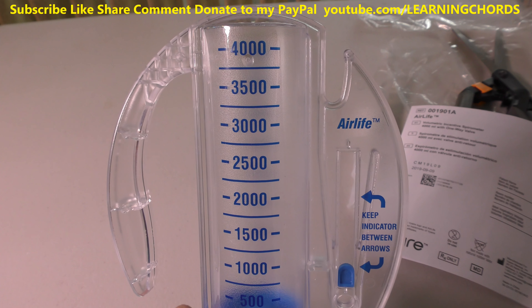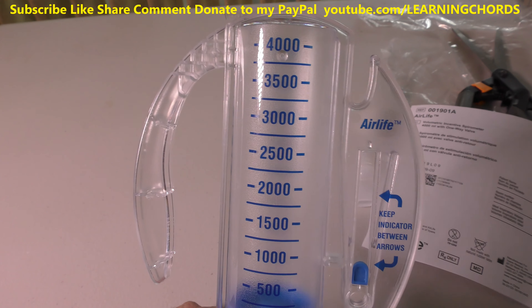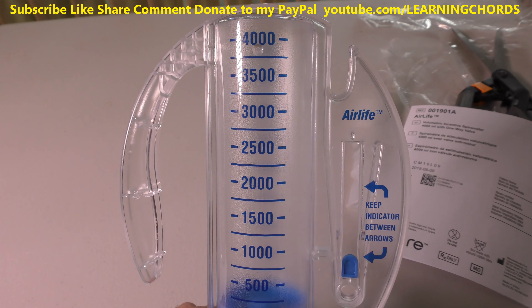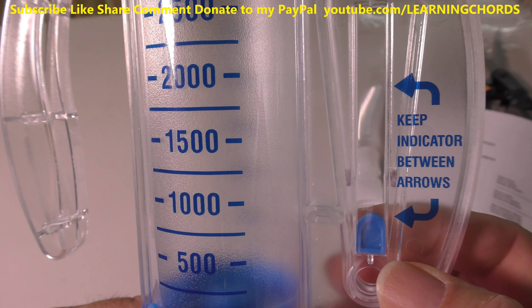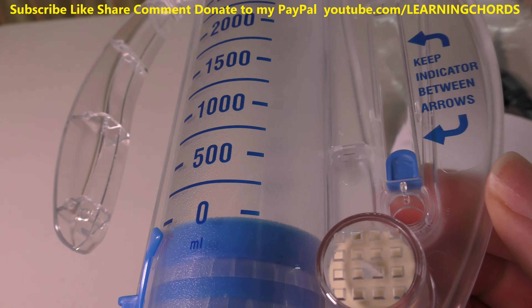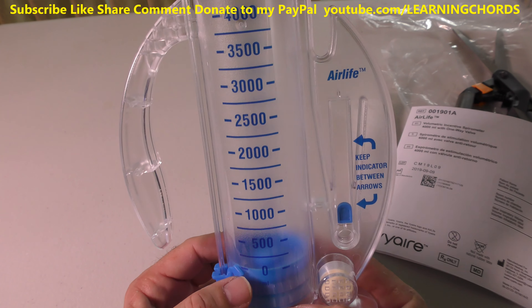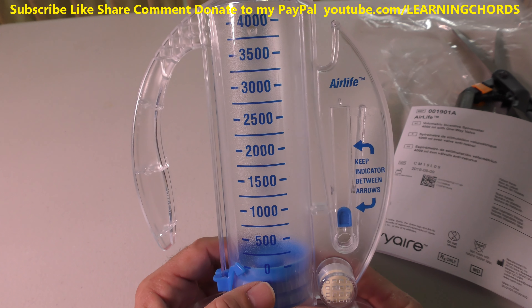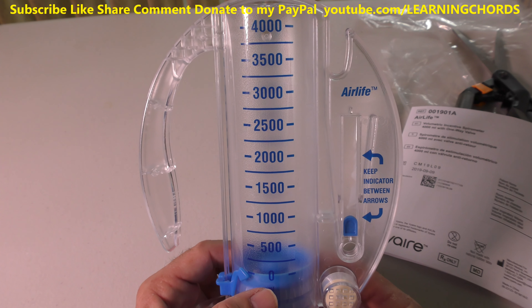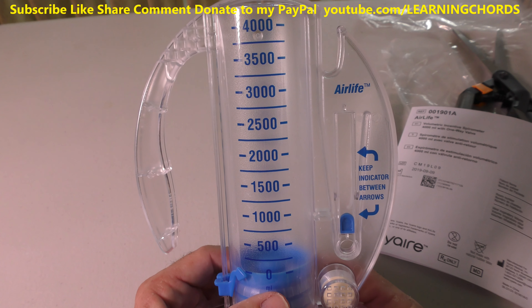Most people don't buy these until they get them from the doctor because they are in serious trouble and need them. So it's better to have it now and practice. It says keep indicator between arrows. I don't really know if that's user adjusted. We have readings over here. I bought this online from Target and I'm going to leave an affiliate link in the video description to buy this on Amazon.